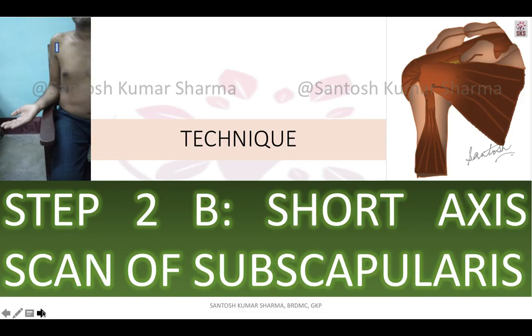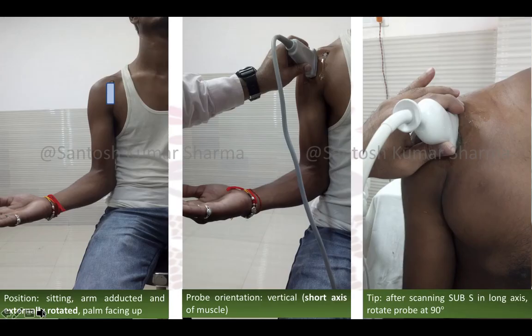Moving on to the short axis scan of the subscapularis, here the probe orientation becomes 90 degrees and the rest all remains the same. So we have rotated the probe and now it is in short axis for the muscle and the probe has become vertical.